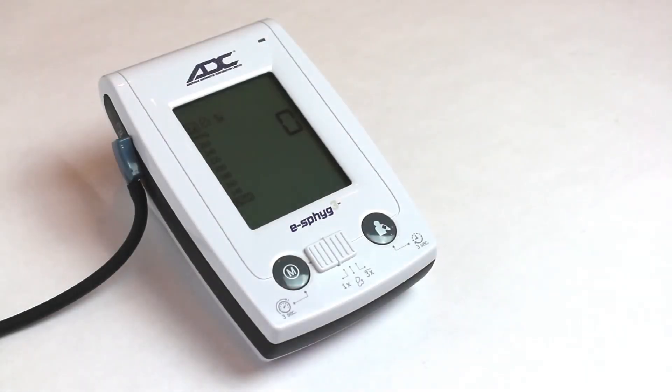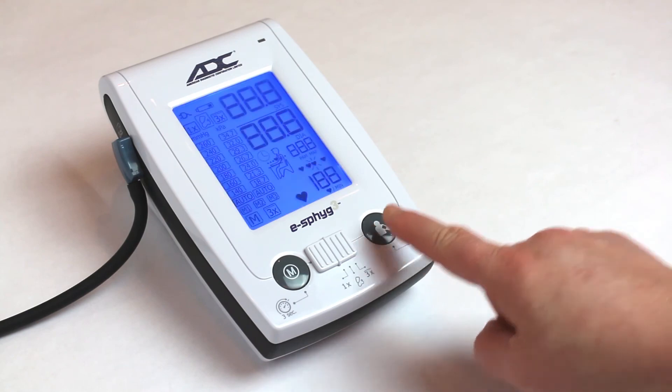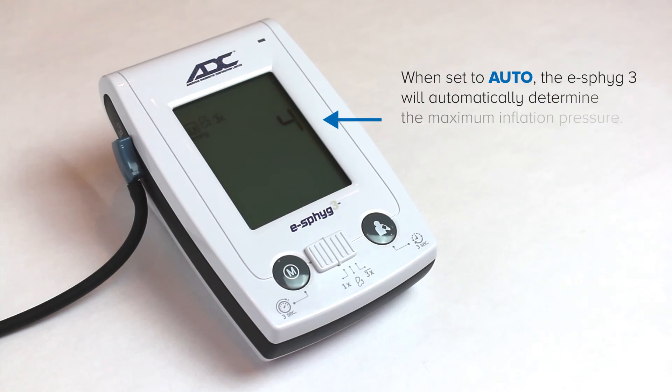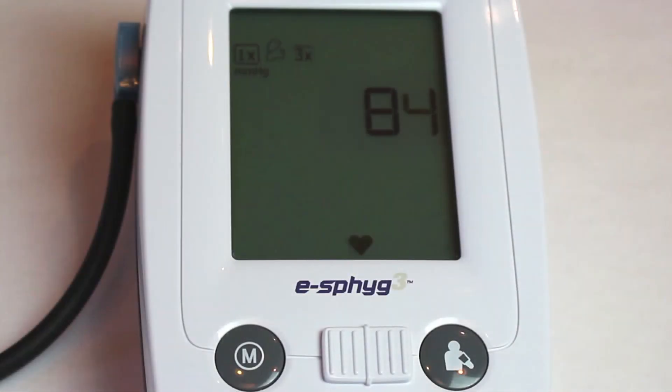With the cuff in place, press the Stop Start button. The cuff will begin inflating. When it reaches an appropriate pressure, it begins to deflate. The reading should appear in about 30 seconds. A long beep will indicate the measurement is complete.